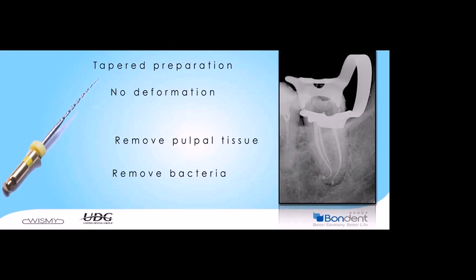First, decrease the number or remove the bacteria inside of the root canal in those cases where there is a necrosis in the root canal, and eliminate the debris that we are going to create during instrumentation and remove the organic tissue that is inside of the root canal.